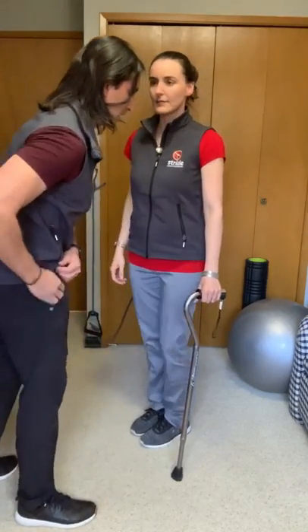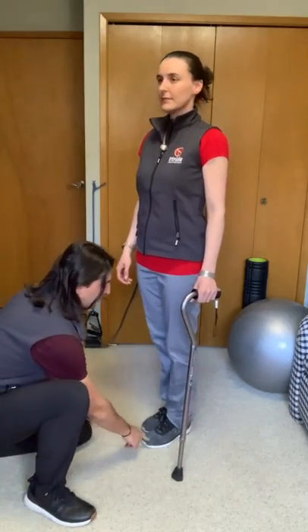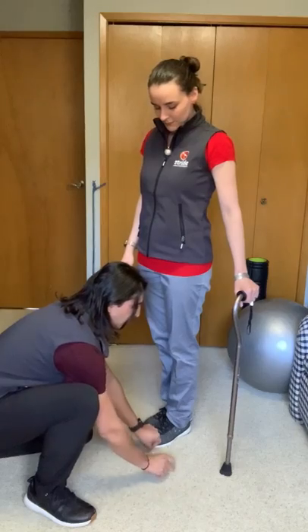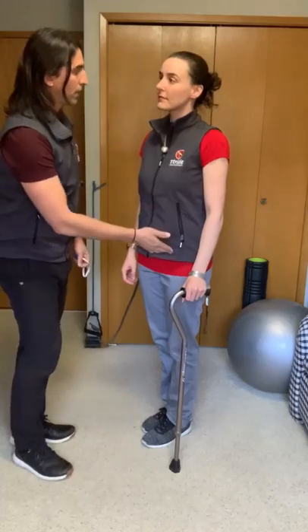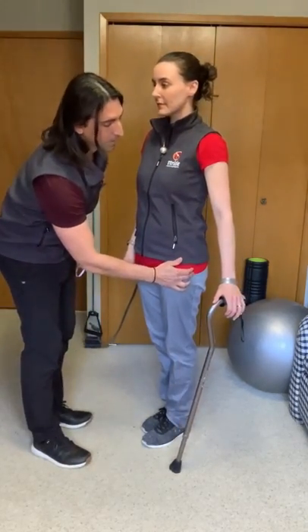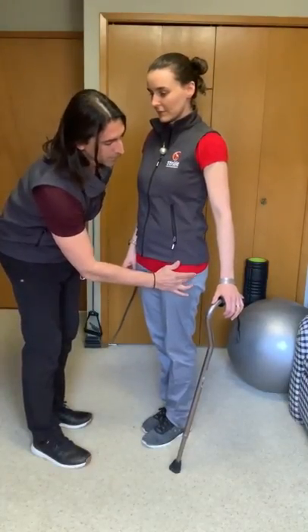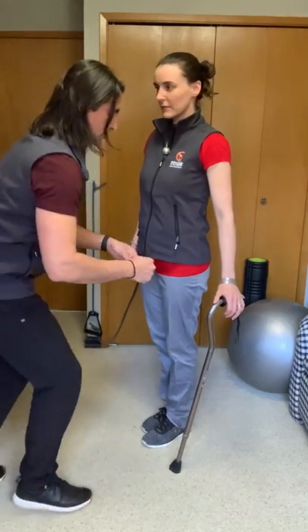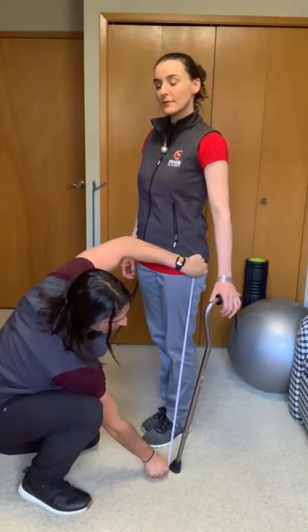So what we want is to measure from the tip of the toes, six inches out — right there. Let's place the cane right there. And then we're going to find the greater trochanter — a prominent bone here at the hip level. From that prominent bone, we're going to measure all the way down to where the cane is. That's 33 inches.